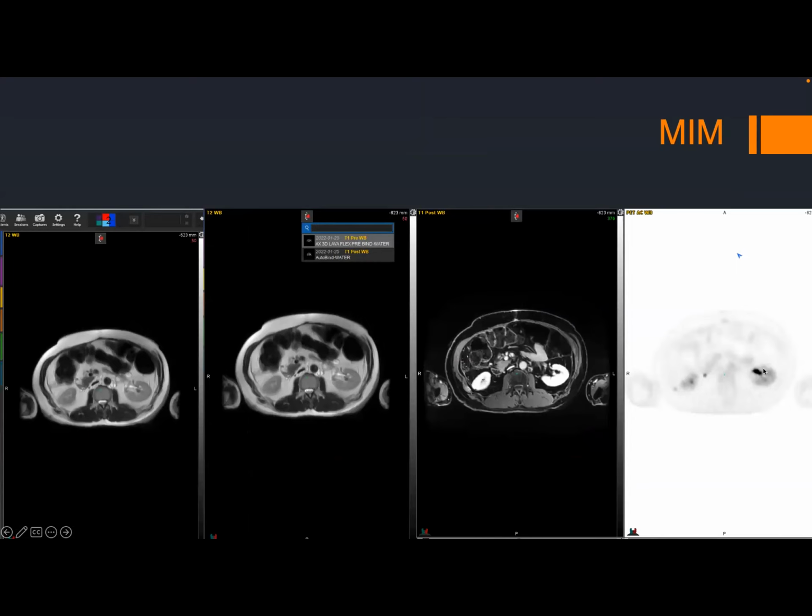So the really nice thing about this is you're able to flip between the MR sequences. This is where it's very helpful. So everything's co-registered, everything's fused, and if you're on the T1 post and you're wondering, is this enhancing? Then you can flip to the T1 pre and actually see without having the images move and slide out of place. Similarly, you can then flip to the T2 and it's actually very, very nice once that's all working.